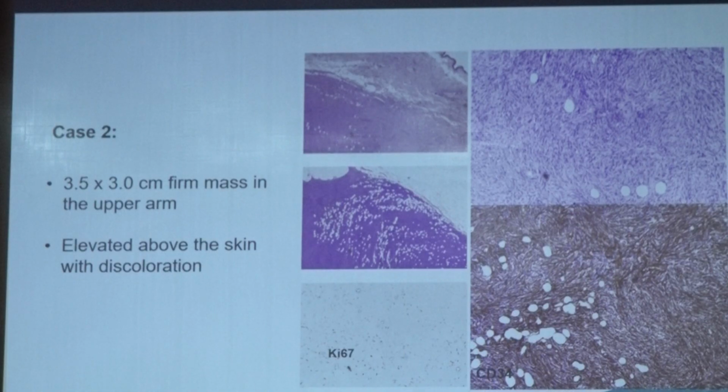Now, if you had to differentiate between dermatofibrosarcoma and dermatofibroma, we have certain subtle points which can be taken into account, like there will be epithelial proliferation in case of dermatofibroma, while the DFSP will have a thinned out skin there. So epidermis will be thinned out in DFSP. The BFH will show a grenz zone, and there will be histiocytes present in that.